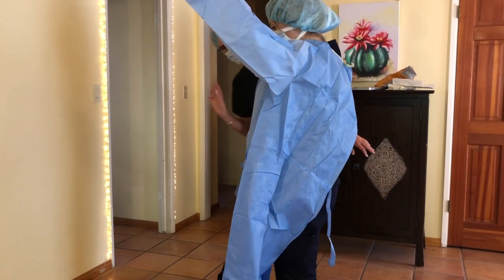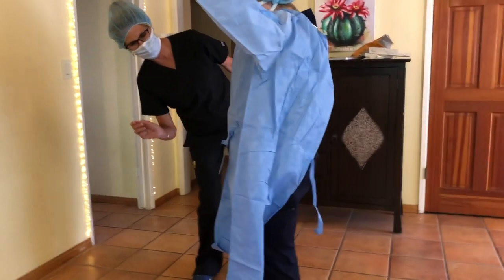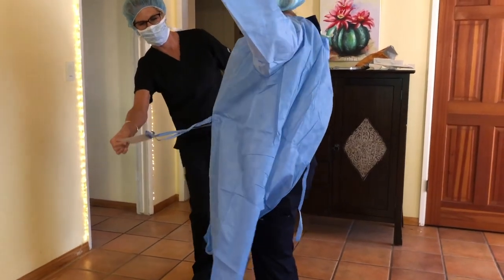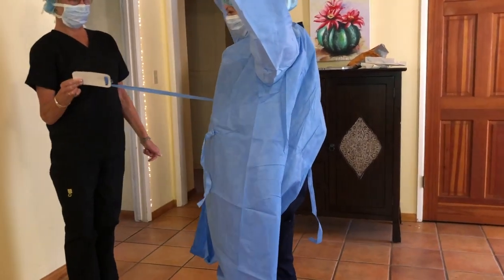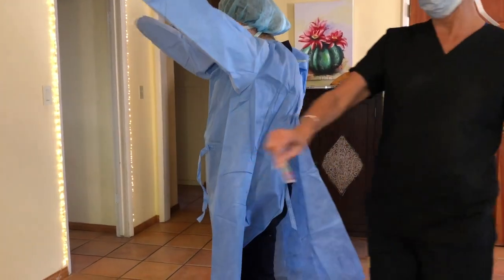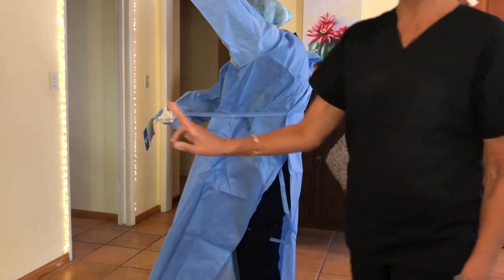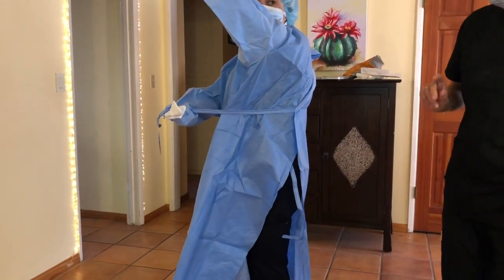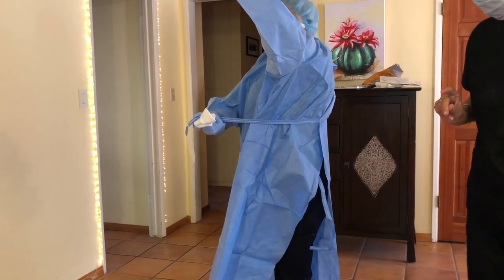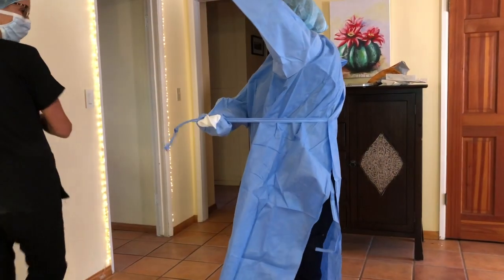there should be a piece of paper that is already here that I will walk around the surgeon. You will grab the string and not the paper, because the paper is now not sterile, and tie it. You have to grab the paper off it. Pull it 1, 2, 3. There we go.